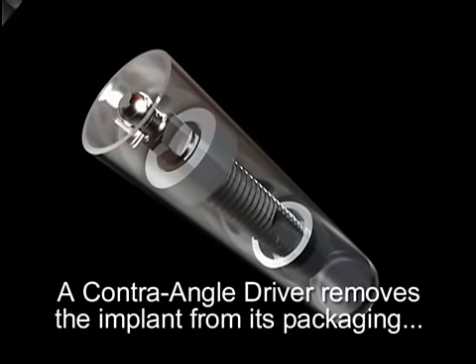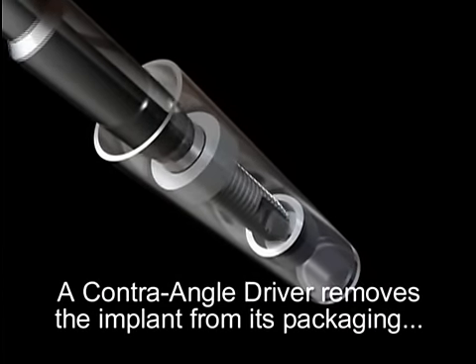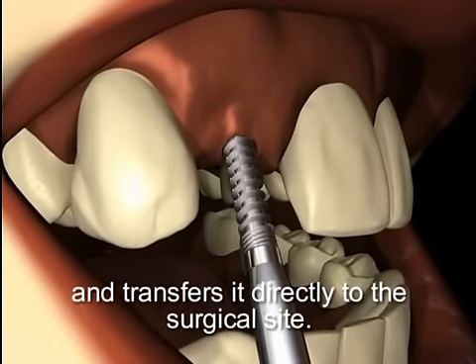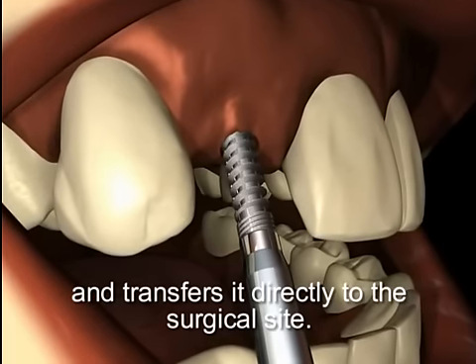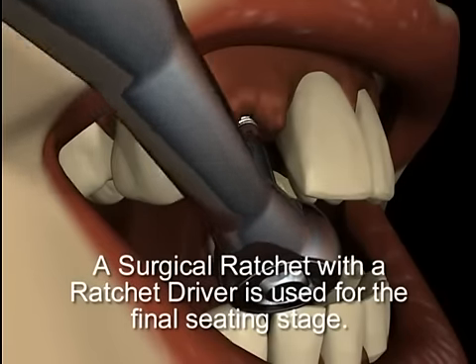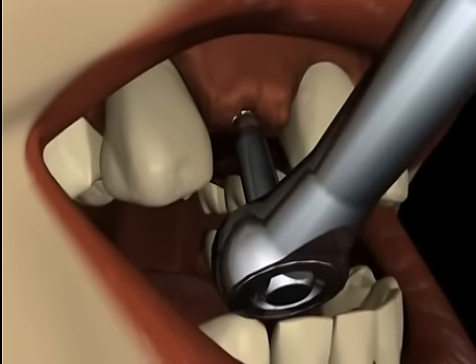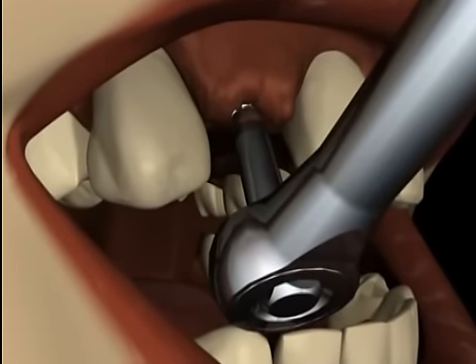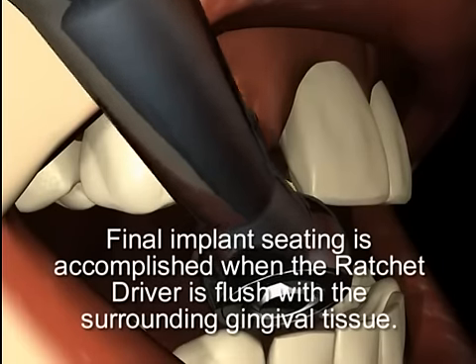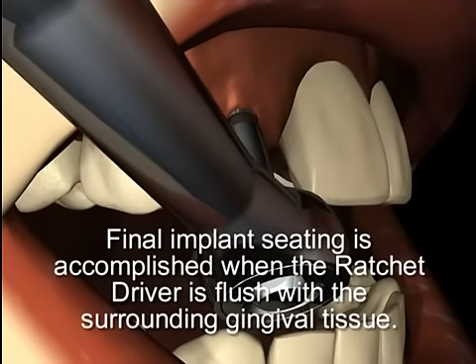A contra-angle driver attached to a slow-speed handpiece slips over the O-ball, removes the implant from its sterile packaging, and transfers it directly to the surgical site for seating at 15 RPM or less. A surgical ratchet with a ratchet driver can be used to accomplish the final seating stage. The ratchet driver is also available in a long shaft version for clearance in narrow spaces. Final implant seating is accomplished when the ratchet driver, or the contra-angle driver, is flush with the surrounding gingival tissue.